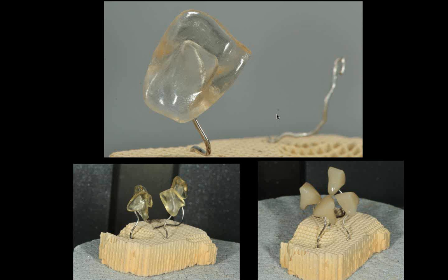Or if you have crowns, we just do it on these platinum pins. We put the crowns on these platinum pins here, and we go through the crystallization process. We don't want to use any of these pastes. That's all fiddling around, all time-consuming. You have to clean out those pastes. It makes no sense. If the material is stable enough, and the zircon oxide does it to the material, which is inside there, that about 10% makes it stable.